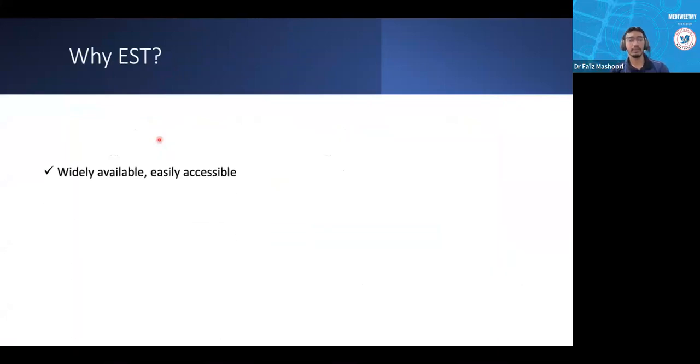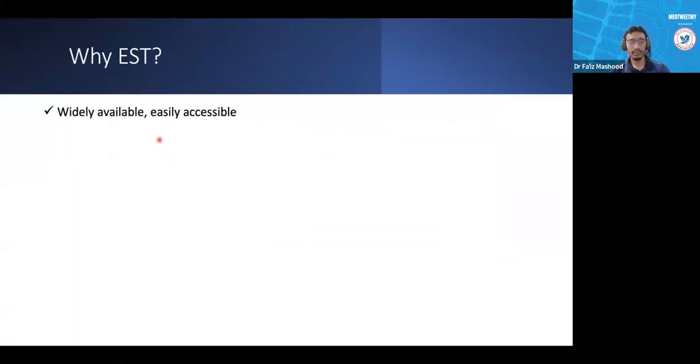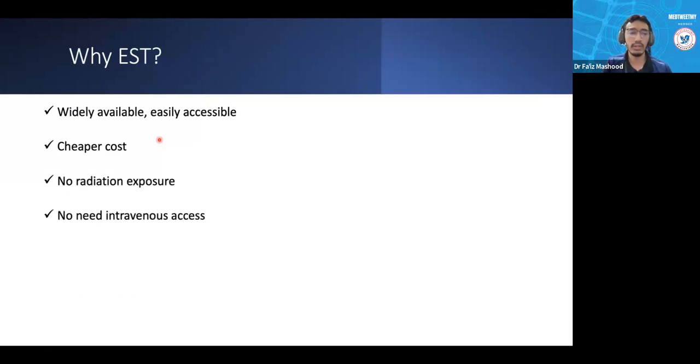Why EST? Firstly, it's widely available and easily accessible. It can be interpreted by non-cardiologists, a well-trained physician, or even a well-trained medical doctor from private or government, and they can give an accurate result. Second would be cheaper cost. CT scan, MRI and nuclear perfusion can cost you thousands, especially in the private setting. And no radiation and no intravenous access needed for EST.